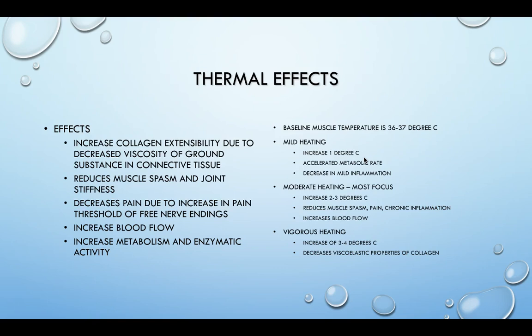Again, we'll use a chart and some equations, okay, in order to find the desired temp that we want to increase. And then our treatment time is going to be based on the temperature that we're trying to reach.